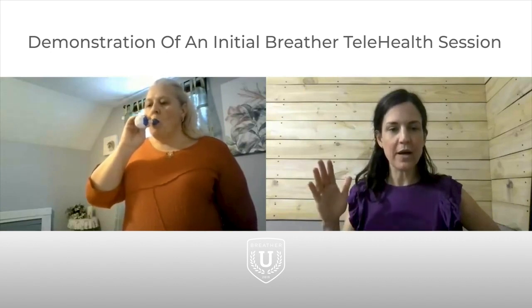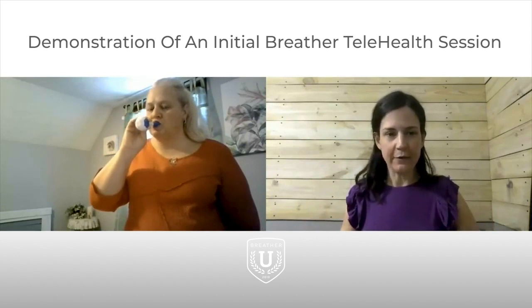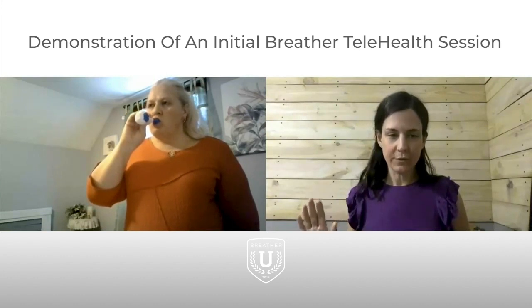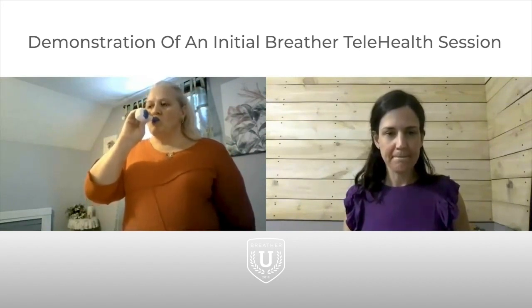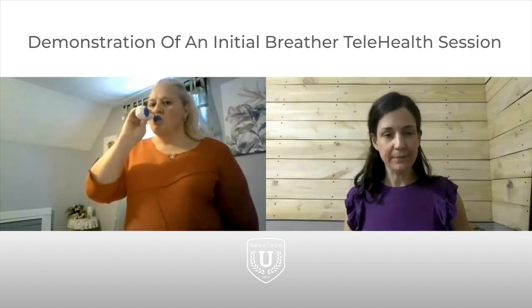A short little pause and then out. All of it out. Good. In. Little hold and out. Good. That's beautiful. Keep going. Good. Remember to use that diaphragm.